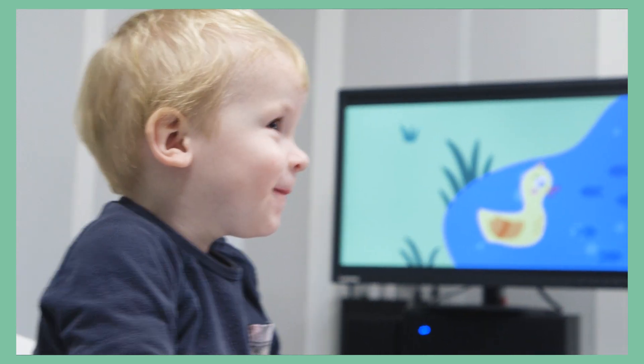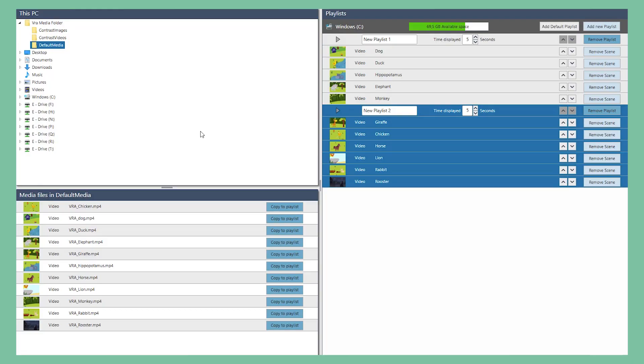When opening the VRA Pure software, you can create your own playlists with content from your own PC. Or you can use the default playlists, also known from the VRA Screen Solution.